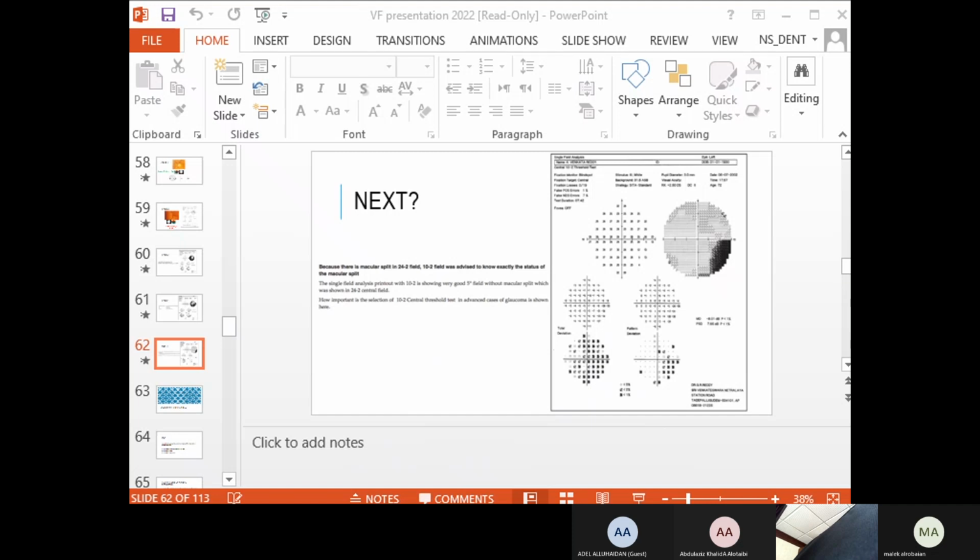Six months later, the patient had this visual field. Why do you think this happened? The test here is also reliable. It's less reliable than the first one. The deviation worsened, yes, minus 3 to minus 6. In general, it is worse here. There are more scotomas, and everything is worse. Why do you think it happened? Might be progression. Okay, good.